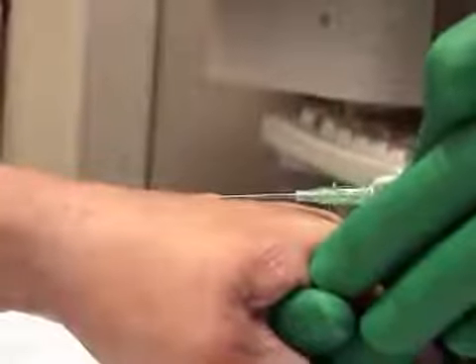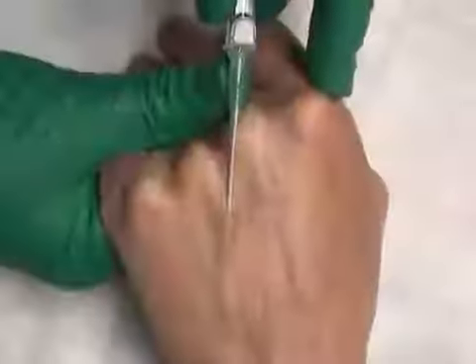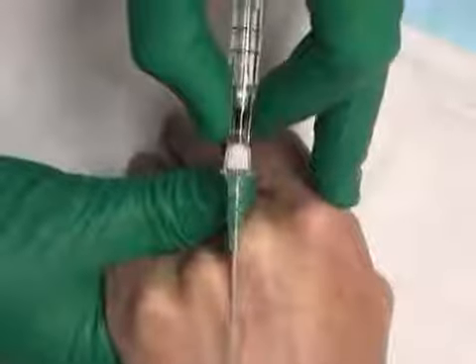The chances of successful peripheral intravenous cannulation increase with meticulous attention to proper technique, the use of proper equipment, familiarity with anatomy, and a knowledge of a variety of approaches to accessing peripheral veins.